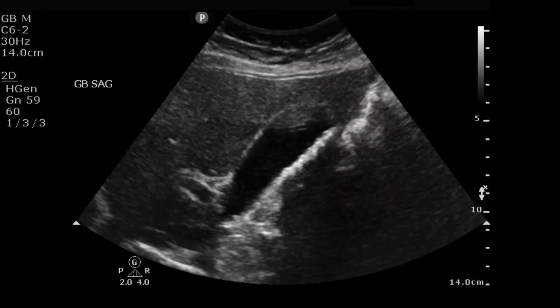And so if we look at this image, we can see all these different types of things come into play. So you see the liver, the main thing in the middle, with this speckled gray appearance. It's the diffuse reflector. Just to the left of the liver is this bright line. That's going to be the diaphragm. So that's our specular reflector.